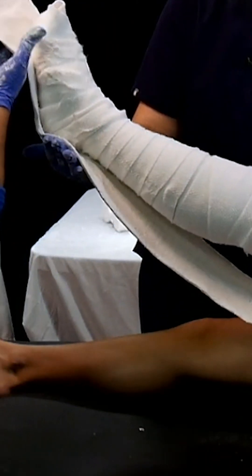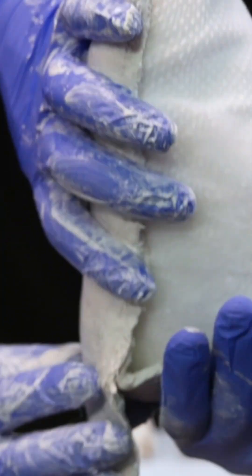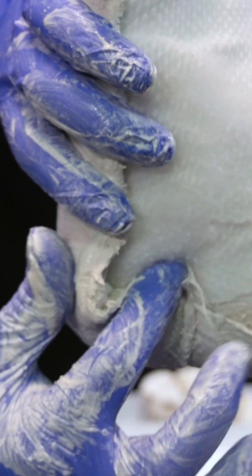He's going to come over now and place this. Let's take note now how he does the foot and the heel. It's kind of like wrapping a birthday present.